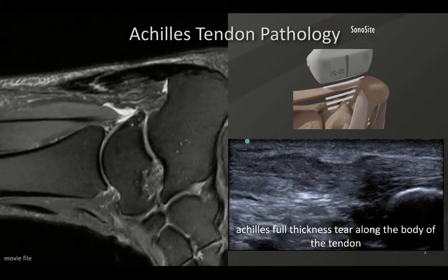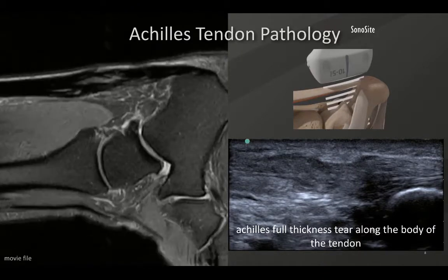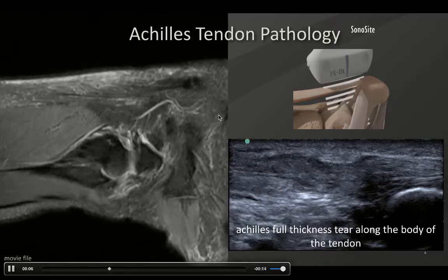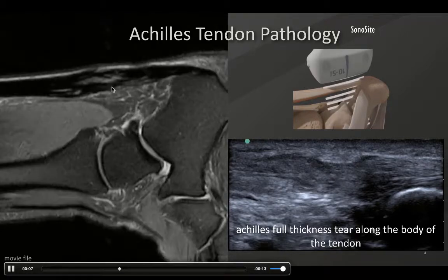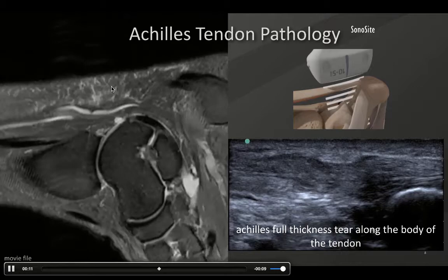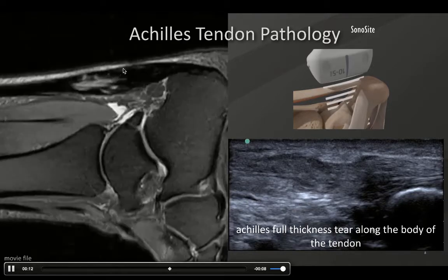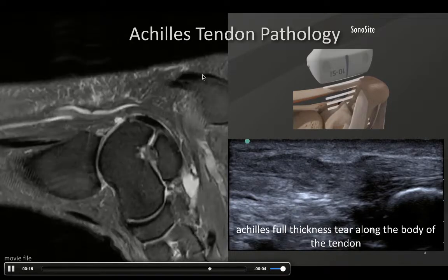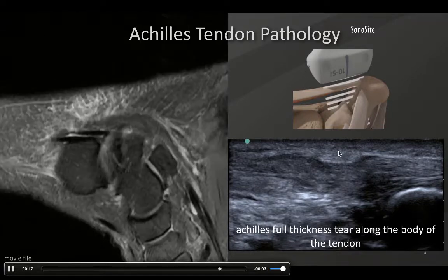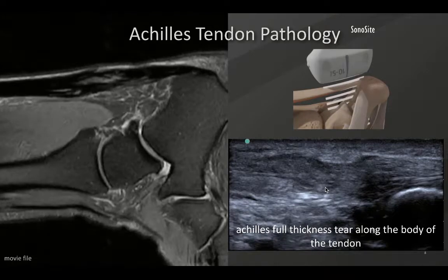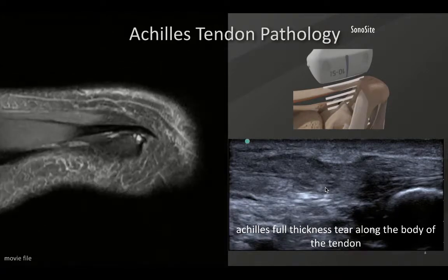Here's an MRI showing a disrupted Achilles tendon with an ultrasound correlation. What we're looking at on the MRI are defects that are letting fluid invade the tendon with very swollen tendon fibers. Notice that the footprint is overall intact, and as we see on the ultrasound correlation, it's very similar — we see all these disrupted fibers and discontinuity.